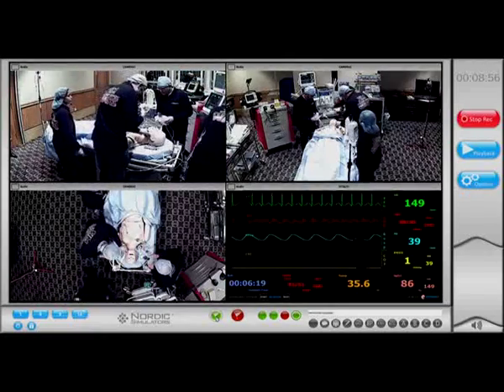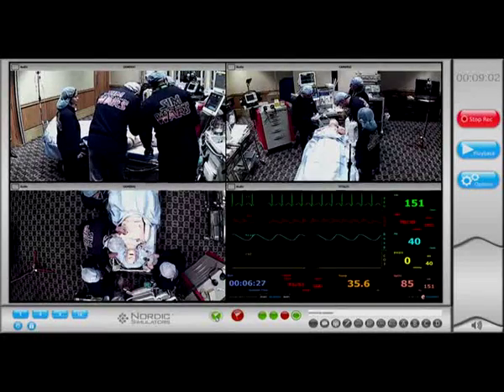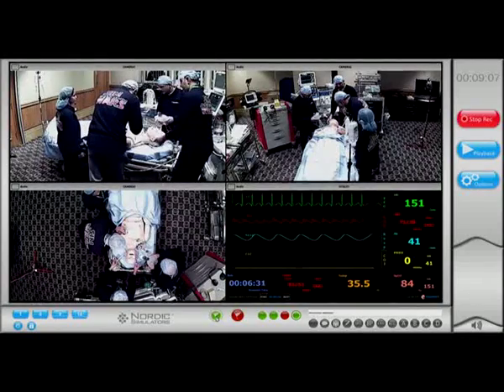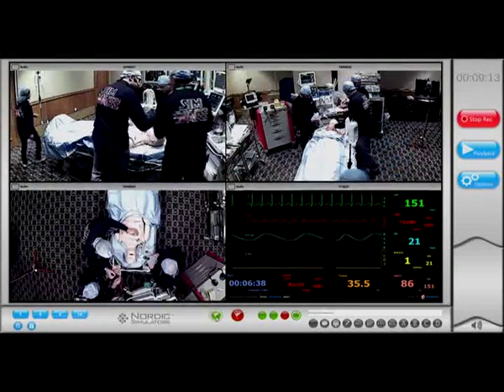Inflate the cuff. It's okay. No air entry, Dr. Yasser. Blood pressure is 64 over 30. I think we should get a chest tube in. Bilaterally? Okay, we'll put the needle decompression on the right side. Cannula 14 gauge. Yes.